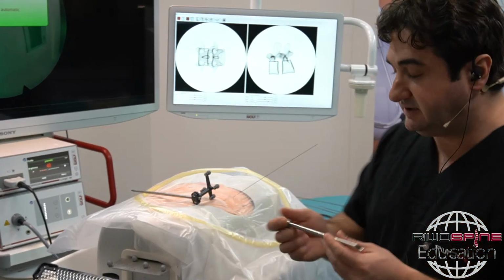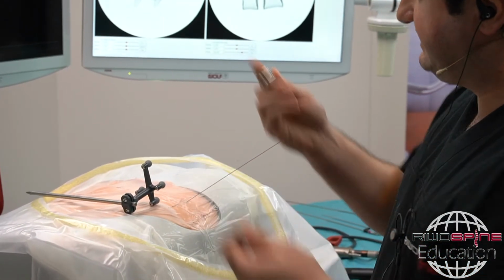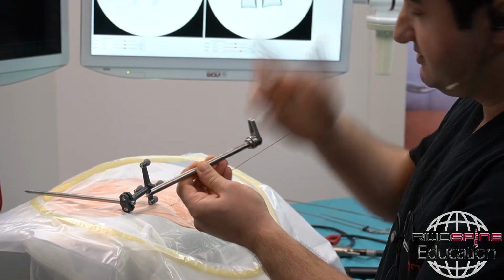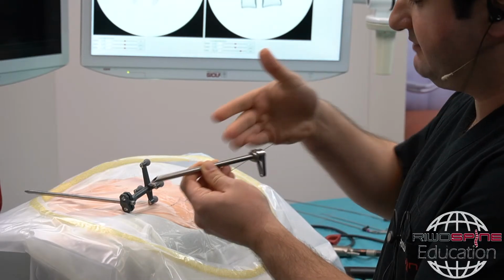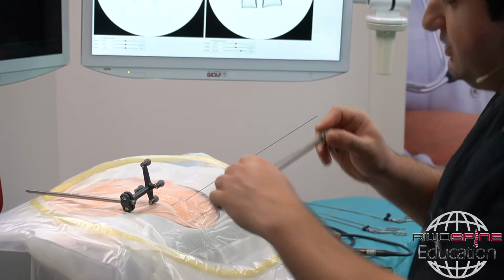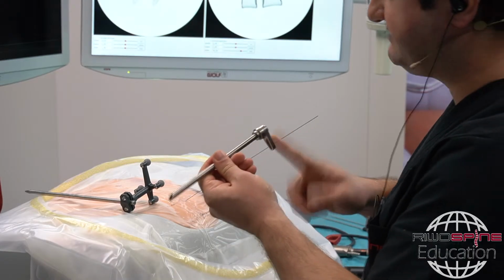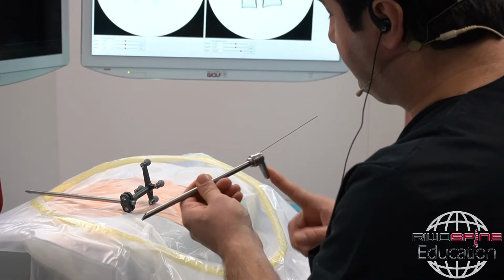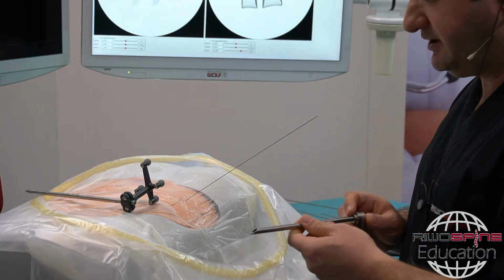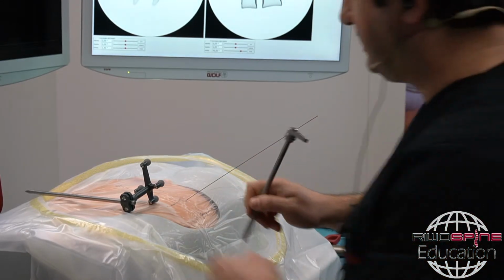We always use the 30-degree beveled working sleeve, and there's an attachment, a handle like that. You can place the handle here like this. Some surgeons prefer like this, and usually we prefer this position. This is very important because while you are inside the patient, you know the opening of the sleeve according to the placement of the handle. Always the handle shows me where is my tip, or where is the opening of the sleeve. I prefer like this because later I will explain why.